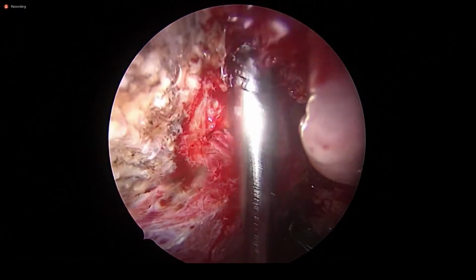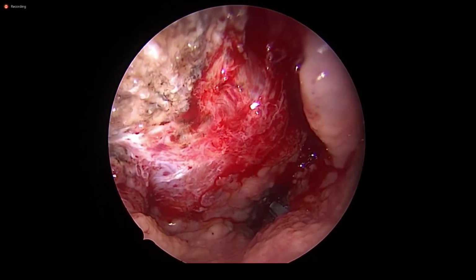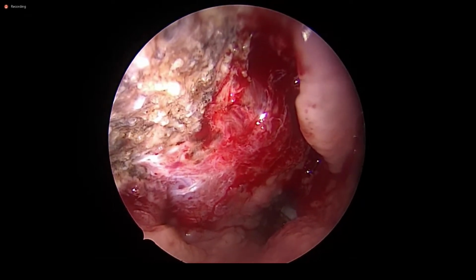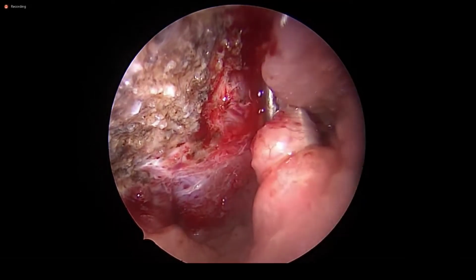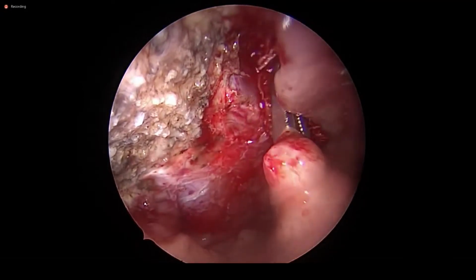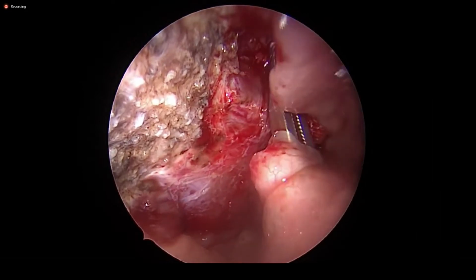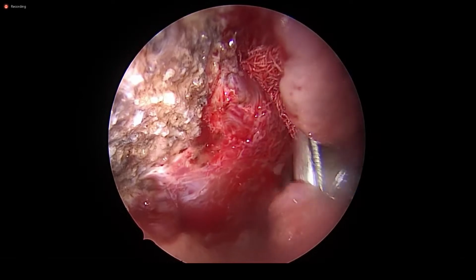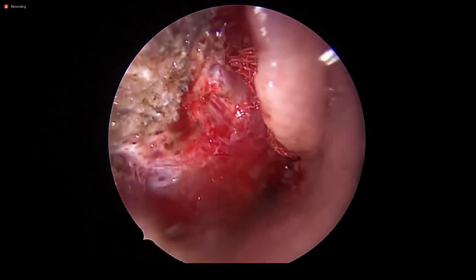Yes, sir. Very nice view, sir. See, without damaging any muscle, a lot of people have a fear of damaging the vessels, the carotid artery and all that. See, there are two thick muscles which separate from the parapharyngeal space: longus capitis and rectus capitis anterior. These are the two muscles which separate from the parapharyngeal area and cover the carotid artery beside the periosteum. See, now the entire fossa of Rosenmuller has opened up laterally.